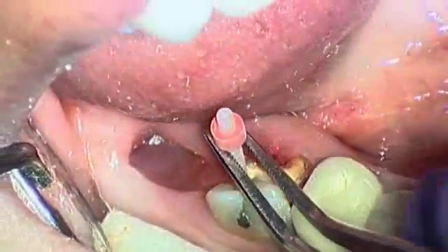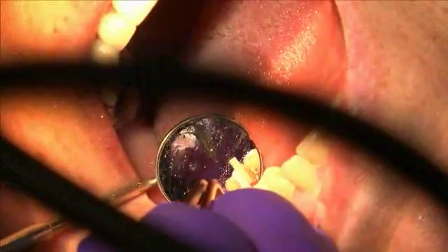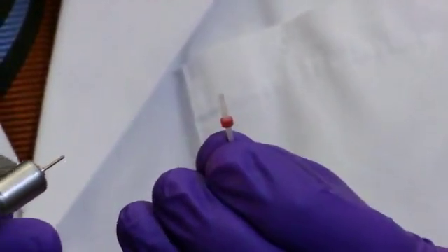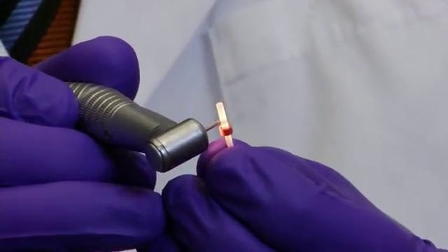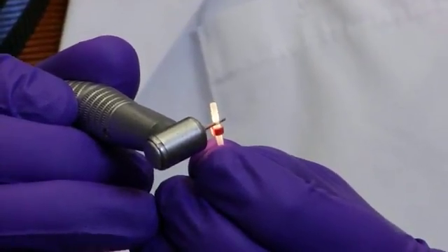Insert the post to check the fit in the prepared canal. You should be able to easily remove the post. Shorten the post to the required length using a diamond disc and suction system. Do not use scissors, scalpels, or similar tools, since they will crush the post and ruin the structure and stability.